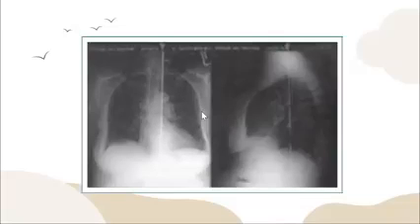So, pag applyan nato ni siya og interpolation, mag-base ang computer sa mga pixels na nasa ihang kilid. So, kung ako computer, black din sa kilid, so dapat black po ko dito. Kani white sa kilid, so mag-white po ko dito. So, siya na ang mag-fill out depending sa mga pixels na nasa ihang surrounding region. Okay, so yan ginabuhat for interpolation. Okay?